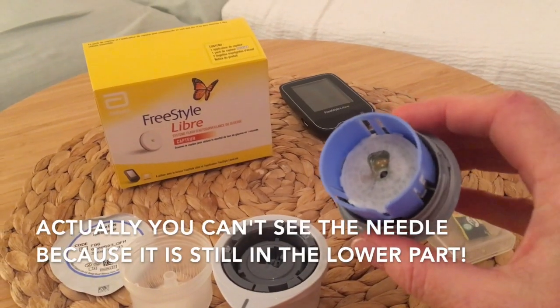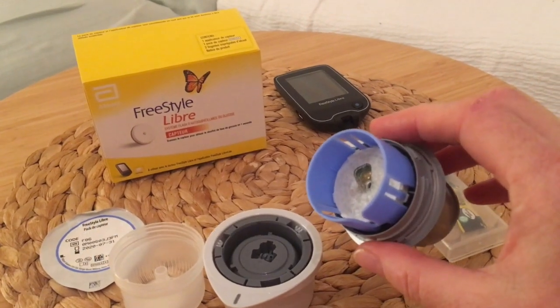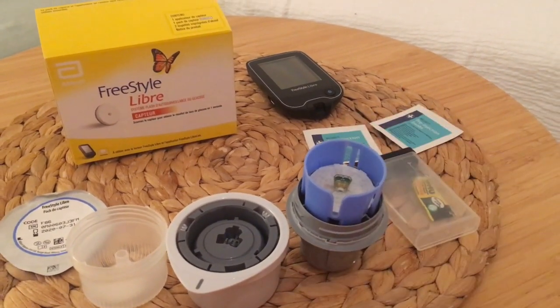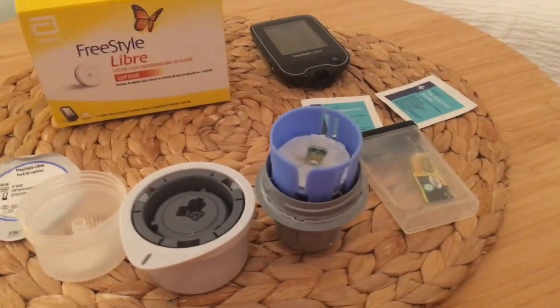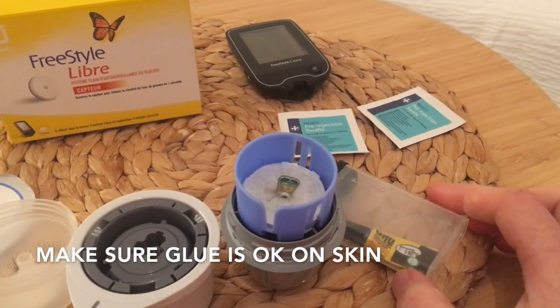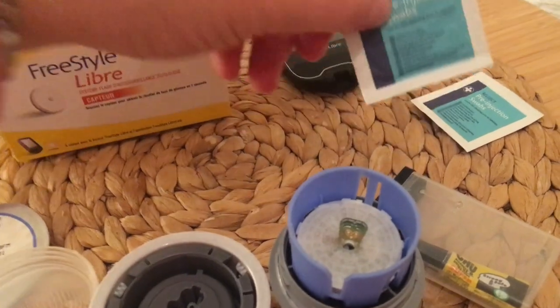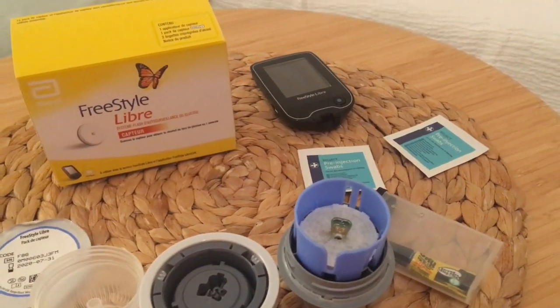There's a little needle that goes under the skin while you apply, but then you remove the part that's used to apply the sensor and there's only a tiny catheter that stays in after application. This is superglue because we're putting it on a cat, and the provided glue for the sensor is not quite enough. And little pre-injection swabs to make sure that we remove all oil off his skin.